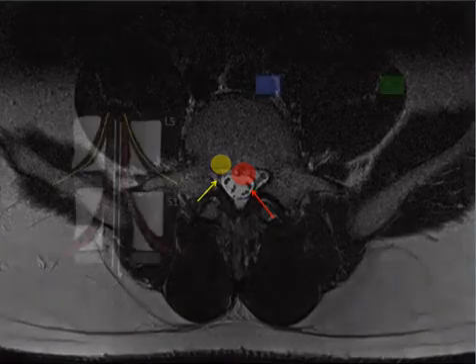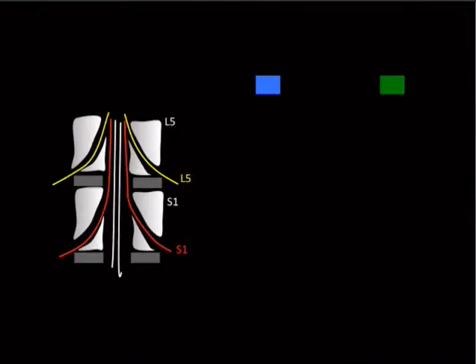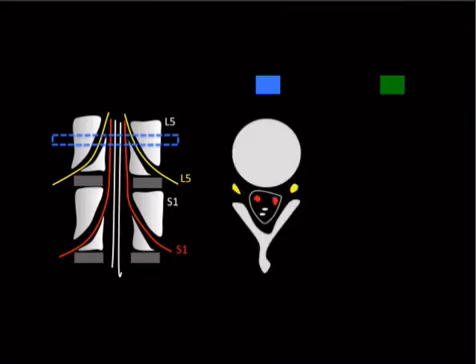That and understanding it. I'll take a diagram here. I've got a blue box and a green box, and we'll take a blue cut right through this level. So that's sort of a coronal, and we're going to take this blue box and make an axial. We're going to see that.